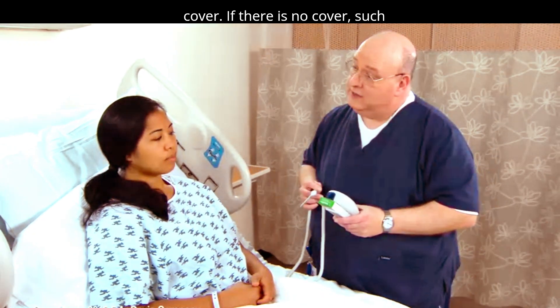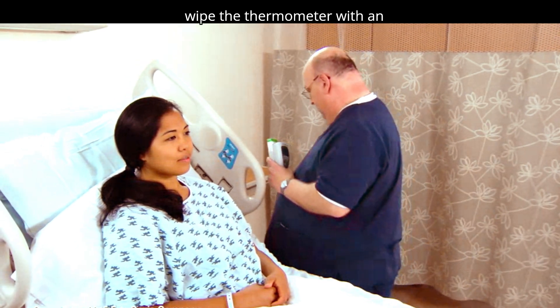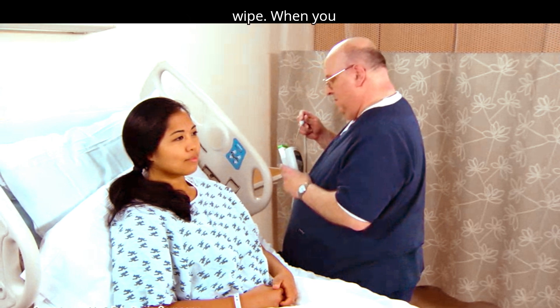If there is no cover, such as for a small individual thermometer, wipe the thermometer with an antimicrobial or alcohol-based wipe.